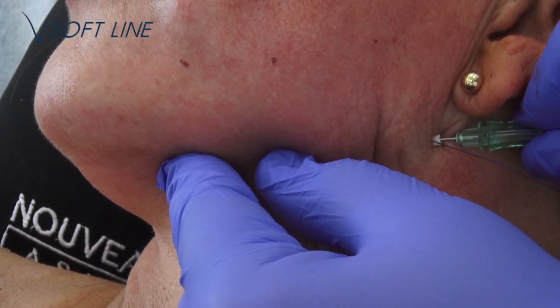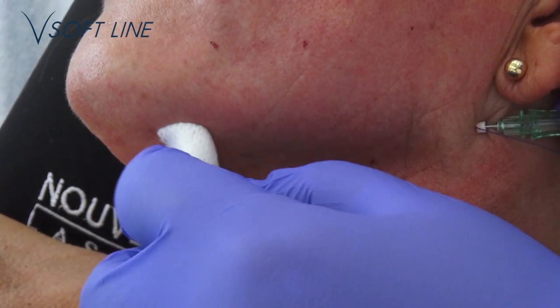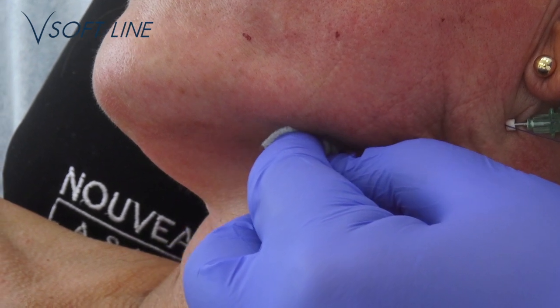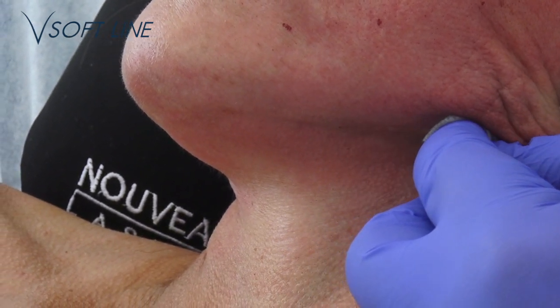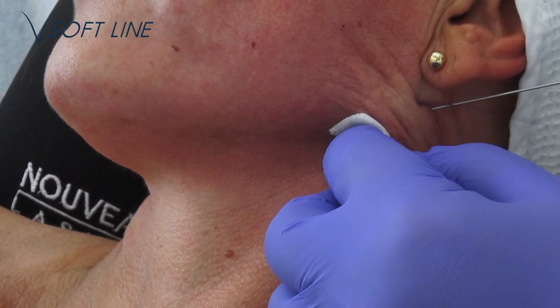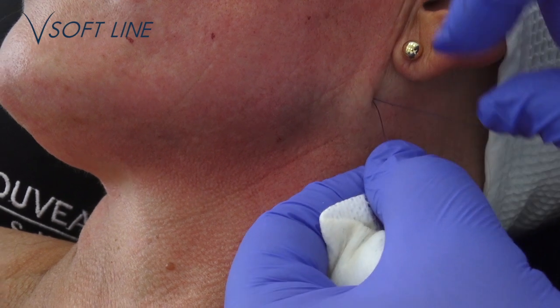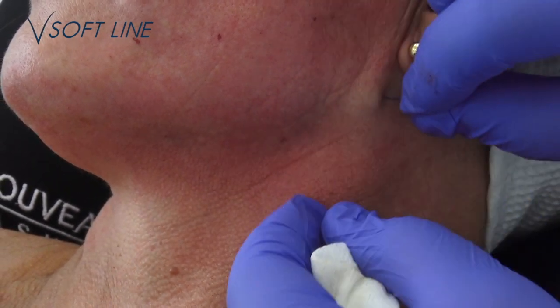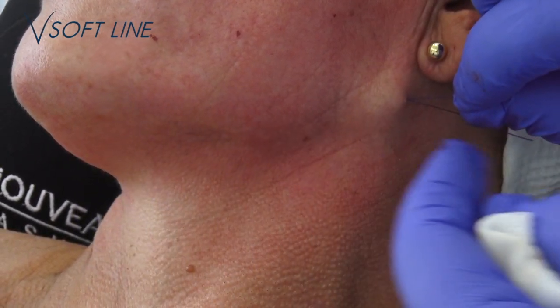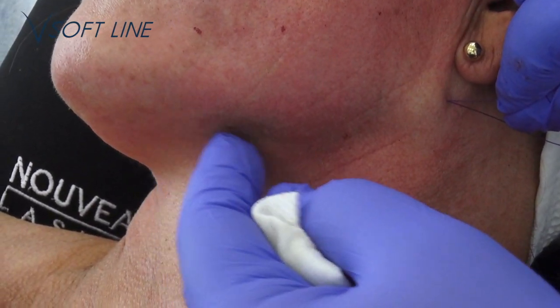Again, press the needle tip to enter it nicely. Good. Keep the pressure here. Stretch the tissue. Pull back the needle strongly. And then we pull it out. Grab the thread and then specifically pull the last one. Ensure it's properly positioned by checking the lifting effect while pulling the thread. Check especially that it's not too superficial.